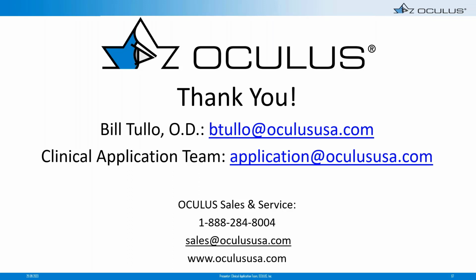And what we recommend is doing sequential scans. If you can get 2 scans in a row that are 24 hours apart, that are not significantly different, I think you'd be comfortable with stability. But if a patient is wearing some extraordinary lenses like gas permeable lenses, it may take several weeks or months even to get their corneas to a stable position.